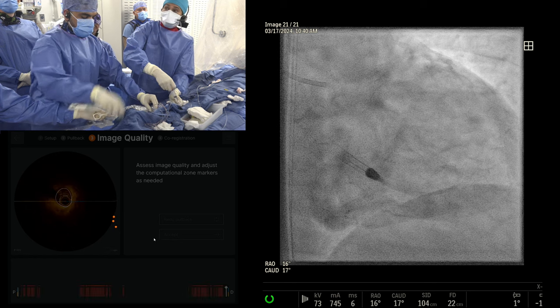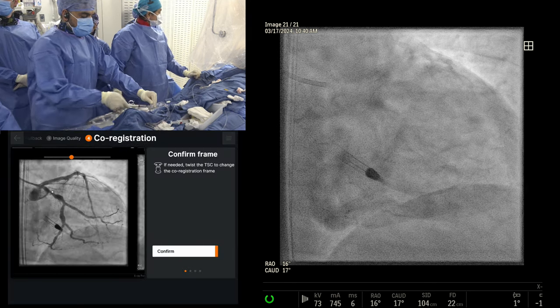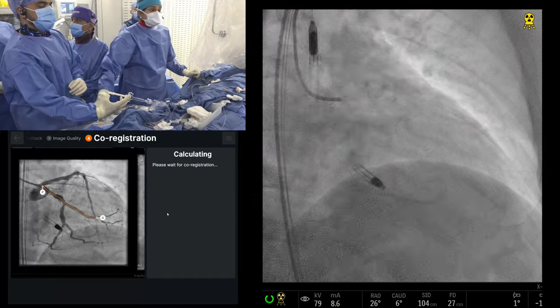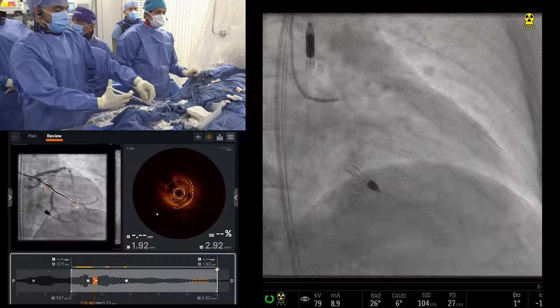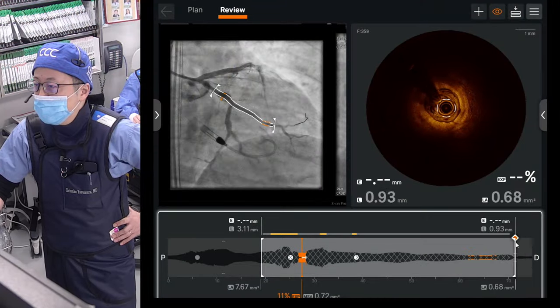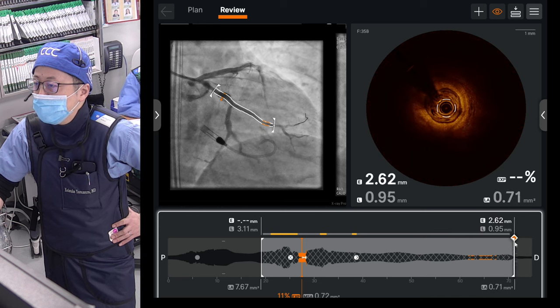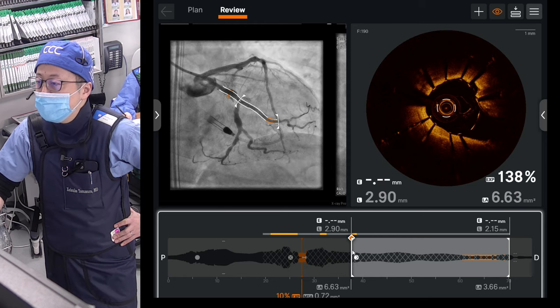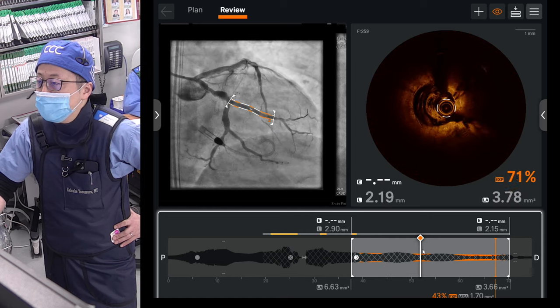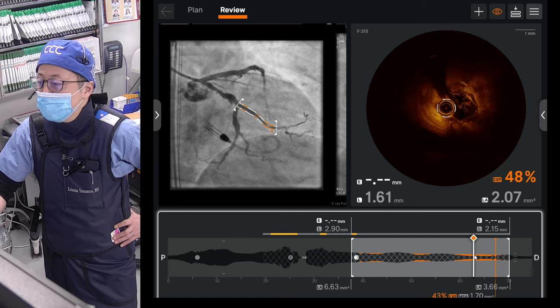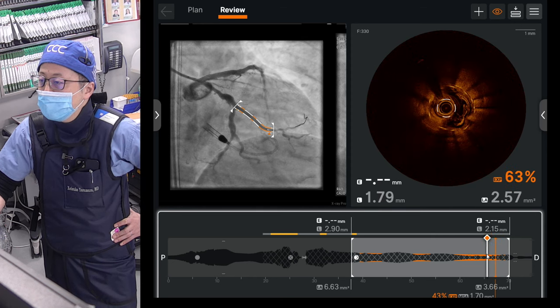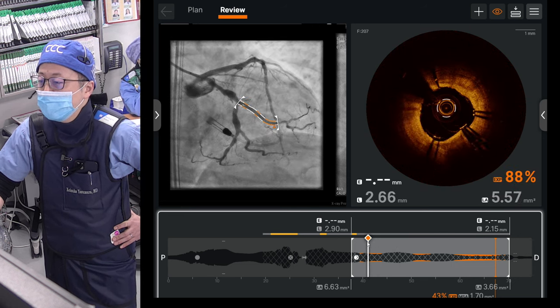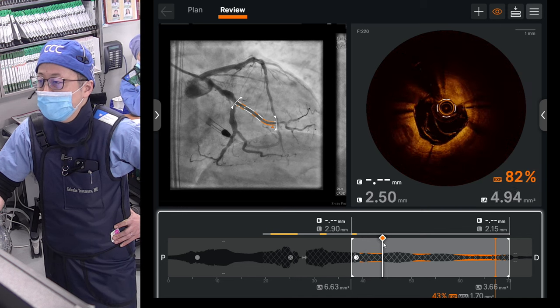Now let's look at the OCT of the OM stent. Doing the angio-co-registration — proximal to distal. The distal edge on the plug shows no dissection, no malaposition. Coming to the proximal edge: exactly at the bifurcation. The stent looks well-expanded. Of course it's a tapering vessel — the distal area is kind of full but well-opposed. Proximal is 6-7 mm². It's a tapering vessel with pretty good expansion — about 90% expansion distally. The distal reference is very tight — more than 100% expansion. Looks terrific.